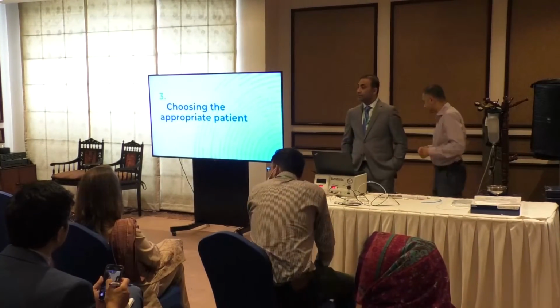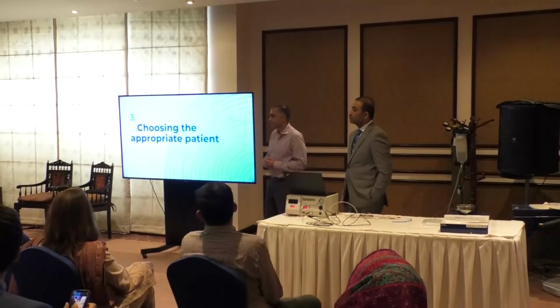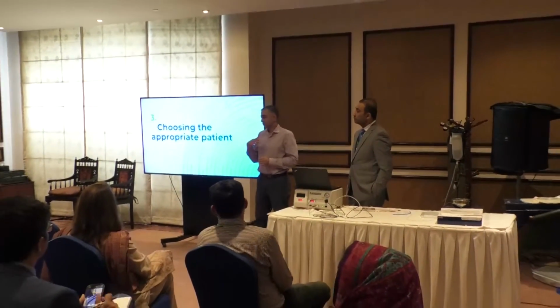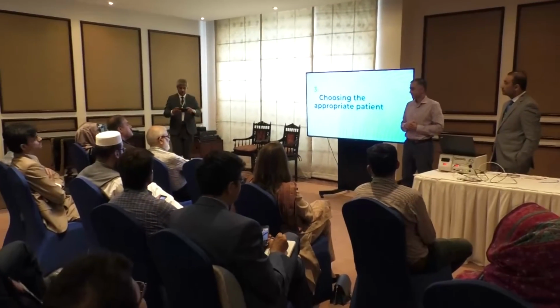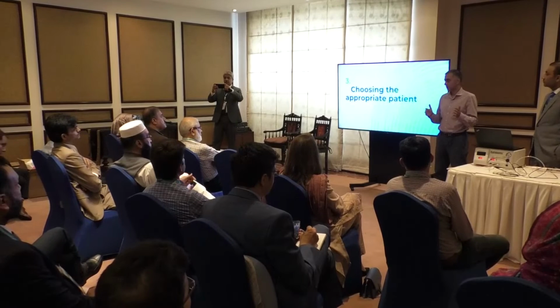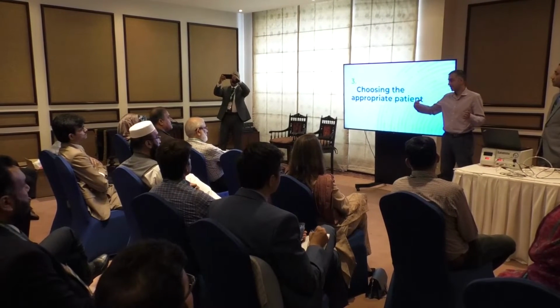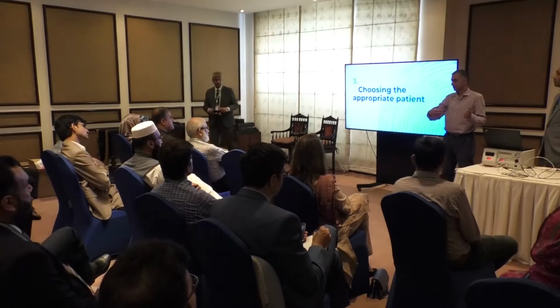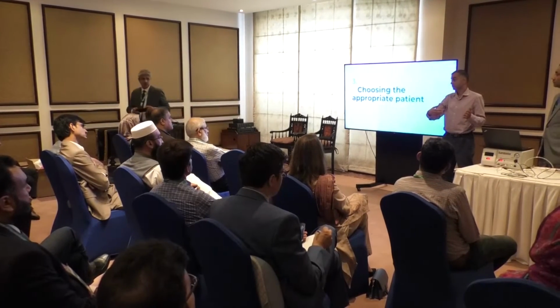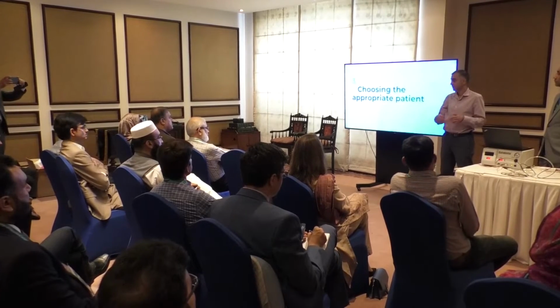Questions? Yeah, please. Sir, the extra wire support. Yes, that's where I use it. I think if you're using the extra floppy wire, it doesn't give you the support that you need to be able to back out your guiding catheter. So that's why I put the extra support wire down.